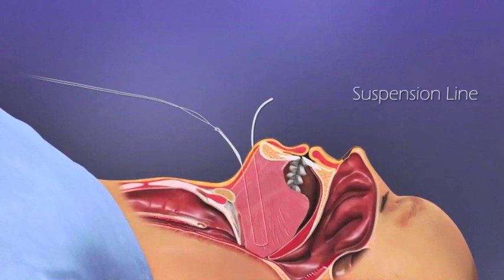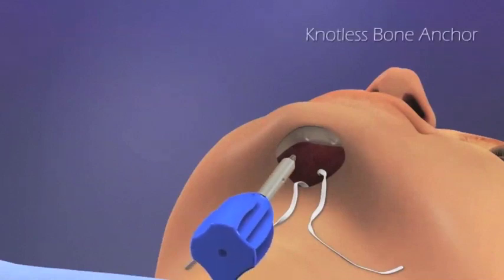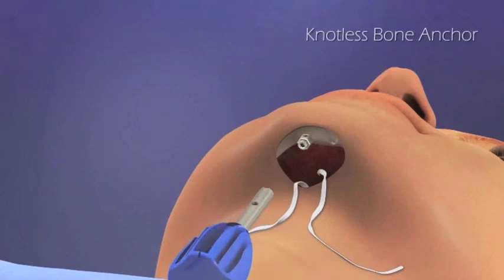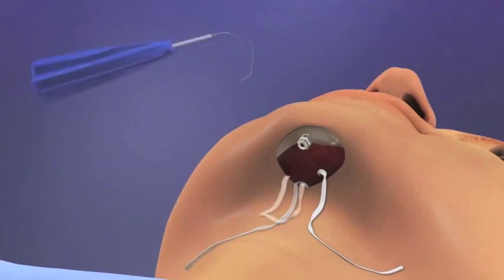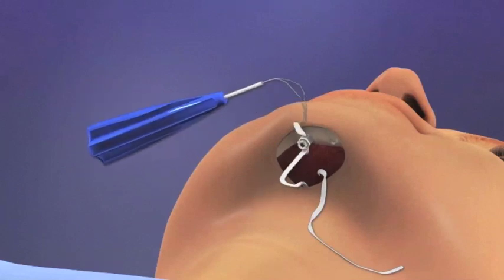A suspension line designed to provide effective suspension of the tongue is now exchanged with the first suture loop. A small titanium bone anchor is used to anchor the suspension loop to the chin. One at a time, the ends of the suspension line are threaded into the bone anchor.